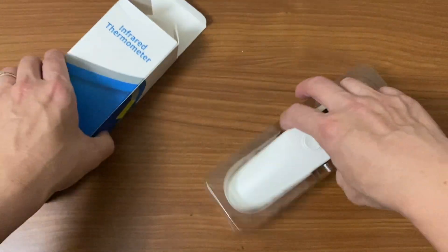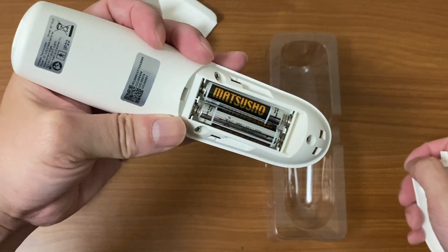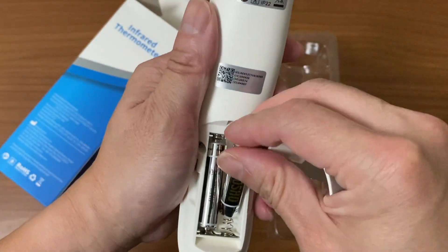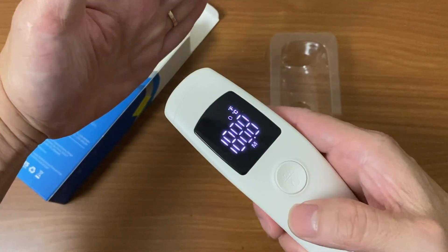Unboxing is quite simple. It doesn't come with any batteries — you use triple-A batteries, which are very small and compact. After inserting the batteries, you point it at someone's forehead, though it does also work on the hand.